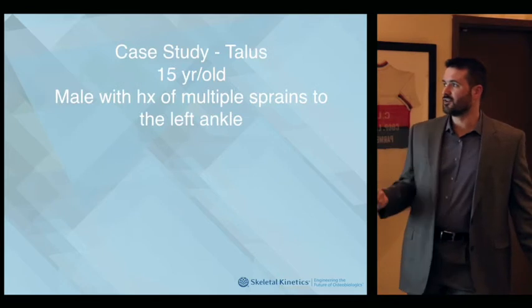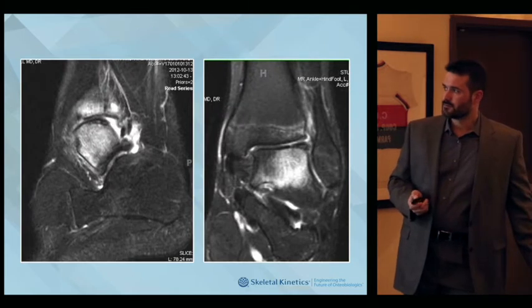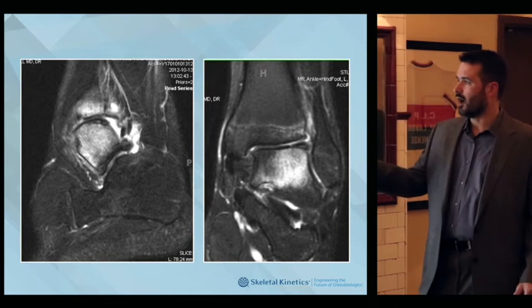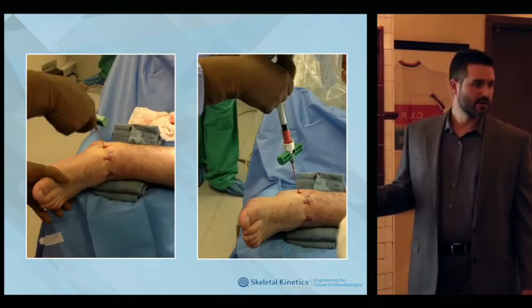So this is a 15-year-old ankle sprain. This is actually an associate's case. This isn't mine, but they're putting in the trocar and injecting it.